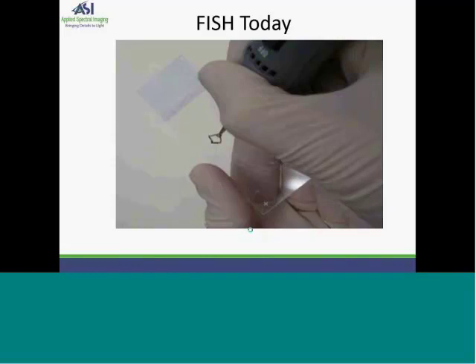ASI's tissue match comes to solve all the problems associated with selecting the region of interest for FISH samples. With tissue match, pathologists will be able to easily and accurately choose the best region of interest on the FISH slide, and to know with certainty that the area scanned was in fact the area which was marked off. Essentially, we want to take away the guesswork and in its place give the pathologist and FISH technician absolute confidence in the clinical relevance of the FISH sample. And we want to do this in a method which will improve the clinical value of the work while lowering the cost associated with it.